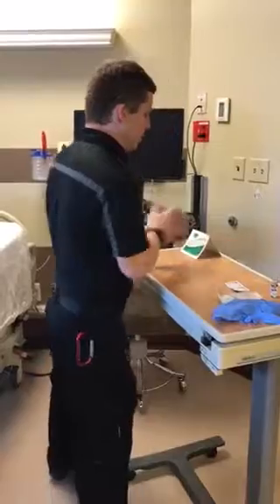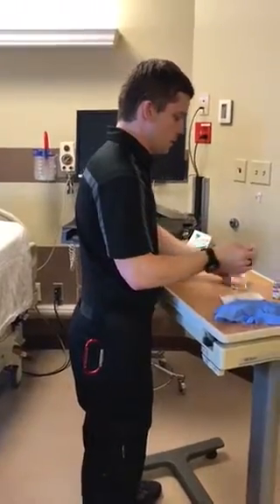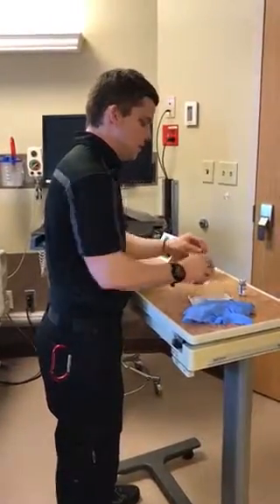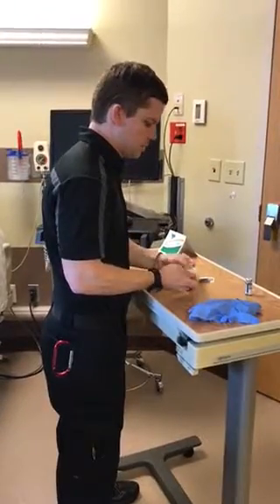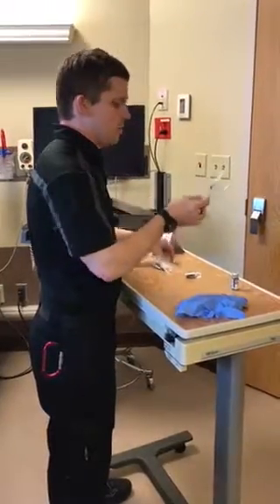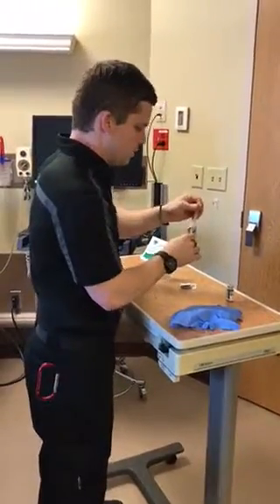I'm going to set that down. I'm going to wash my hands and dry my hands. I'm going to open up an alcohol swab. And I'm going to clean the vial. And I'm going to set my alcohol swab off to the side here. I'm going to let that dry for 30 to 45 seconds while I prepare my syringe. Get that open. Got a 3 milliliter syringe here. I'm going to pull out the desired amount, which is 0.5 milliliters in air. And that should be dry now.